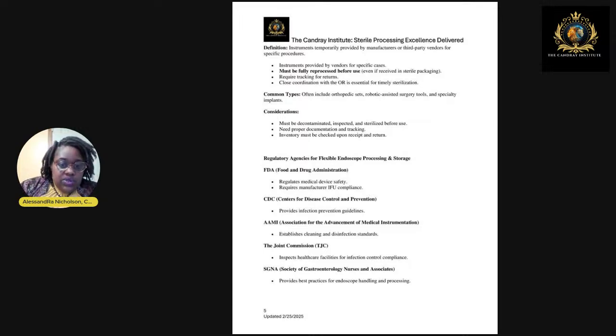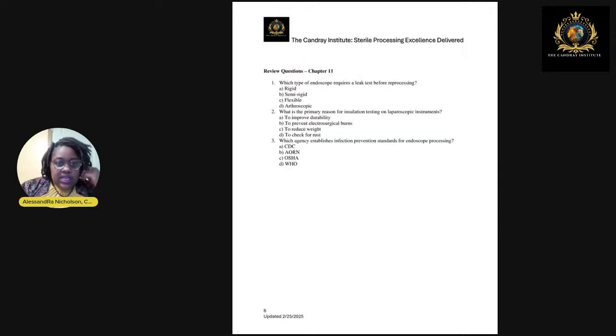Okay, so let's do some review questions real quick. Looks like we got about 10 minutes left, so we might get into a little bit of chapter 12 today. All right, so which type of endoscopes require a leak test before you reprocess it? A, rigid, B, semi-rigid, C, flexible, or D, arthroscopic?